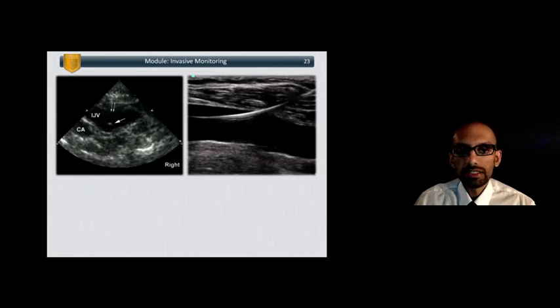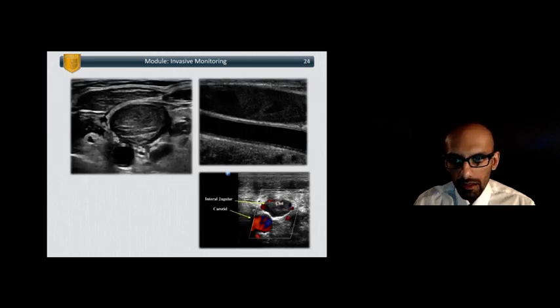And in this case, what you see is guide wire placement within the internal jugular vein correctly placed here, and you see the in-plane view with the wire coursing through the internal jugular vein. So get used to ultrasound images as much as possible, wherever possible, for the ABA exam. They are including more both static and dynamic images, even animations, a lot more so these days. Try your best to look for abnormalities in images, whether that's chest x-ray, ultrasound imaging, CT scans.